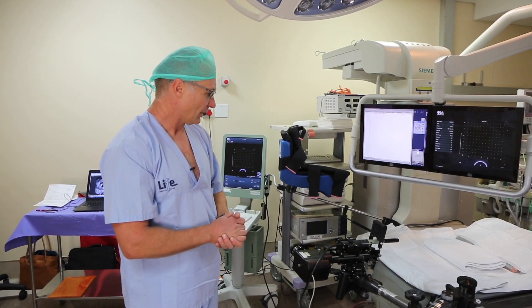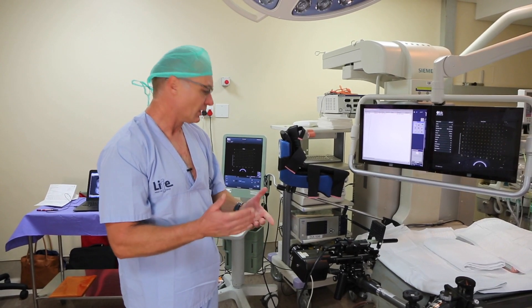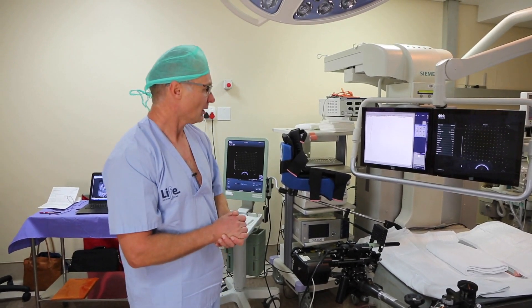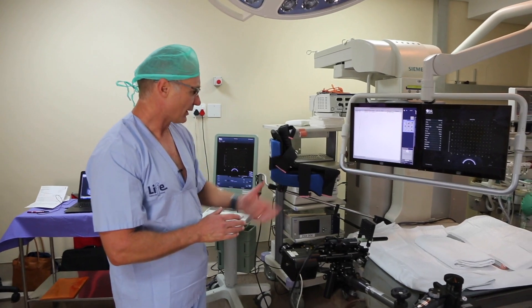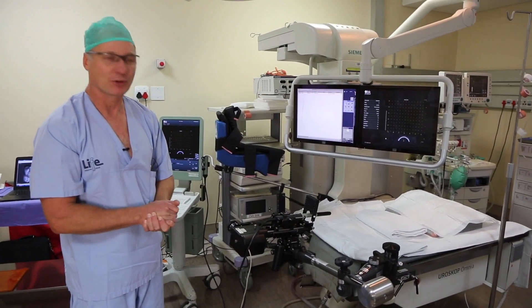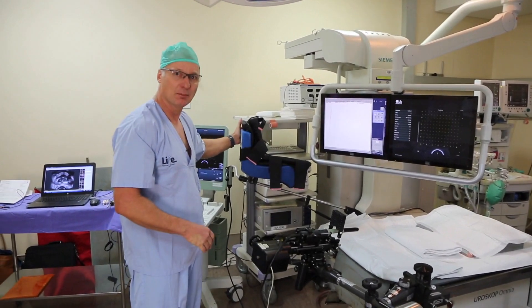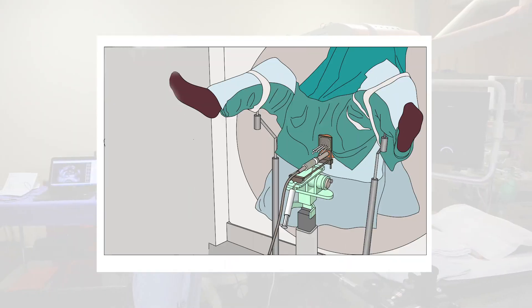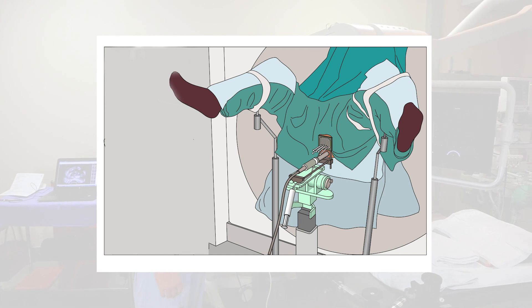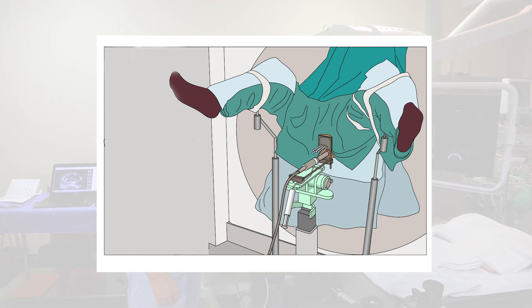How we do that is we work on a three-dimensional planning system. The patient will be set up on the bed in a little bit of an uncomfortable position because we have to get the legs up nice and high in the air. This opens up the perineum because we have to get the needle through the perineum into the prostate.